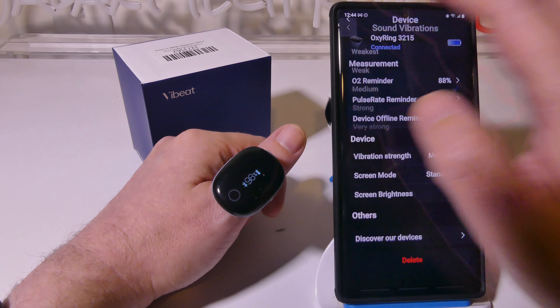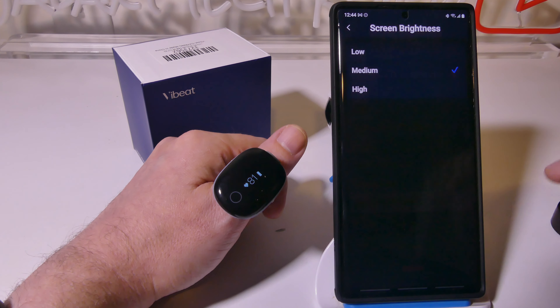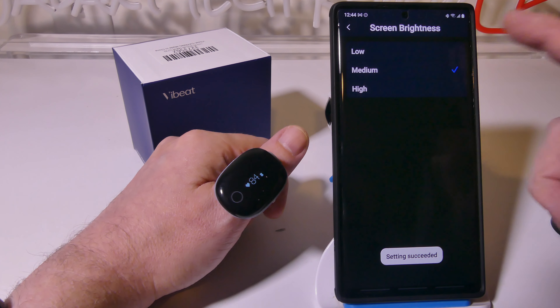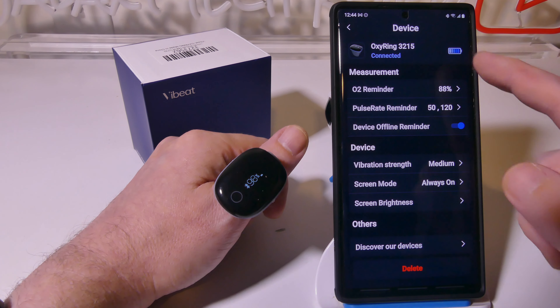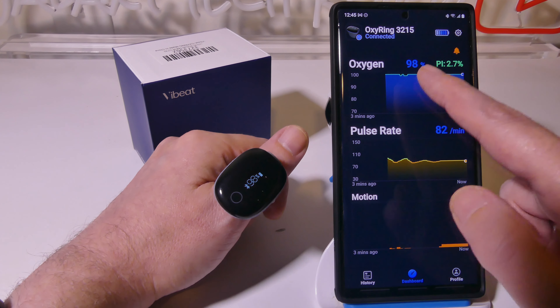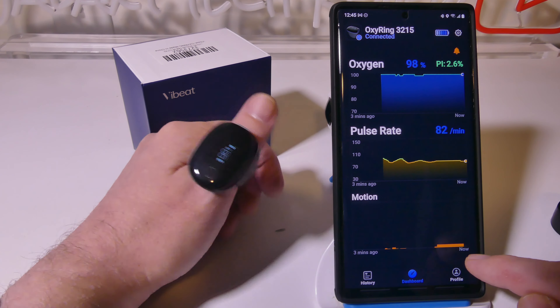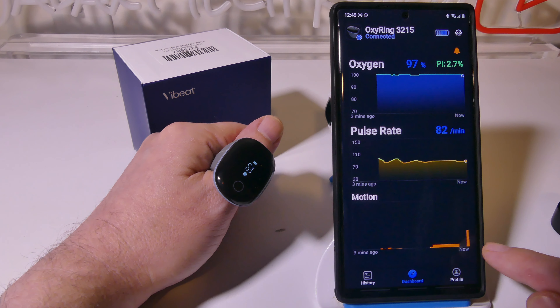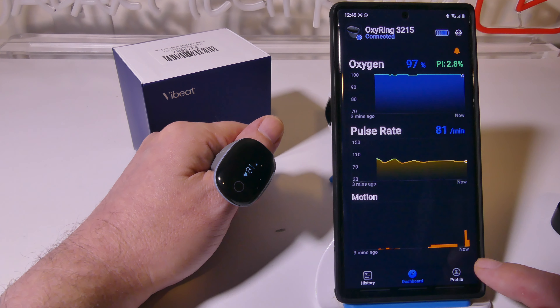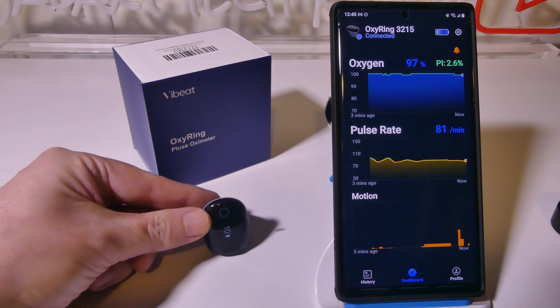I also have some settings here that I can adjust. You do have your O2 reminder — if it drops below 88% you can change that threshold to whatever you would like, and you can get a vibration. Your pulse rate reminder has a low end of 50 and high end of 120 by default. You can change the vibration strength from weakest all the way to very strong. Screen mode can be set to always on or to timeout to save battery life, and screen brightness can be low, medium, or high. If you have the screen mode on always on and vibration strength at the highest, you're probably looking at more like 12 hours, but if you have it timed out you can get closer to 14–15 hours out of this.